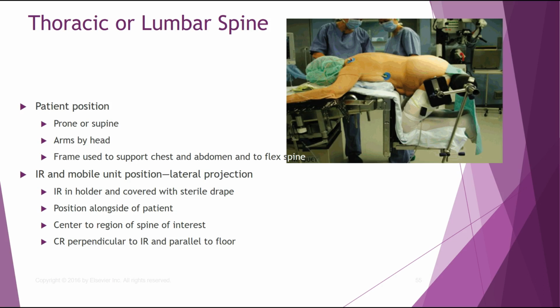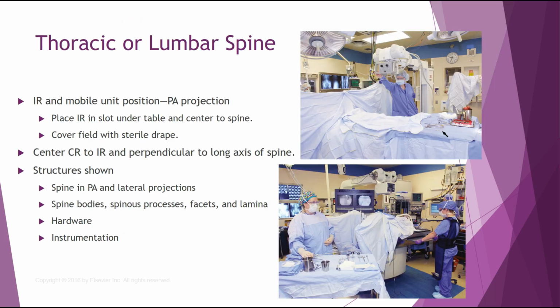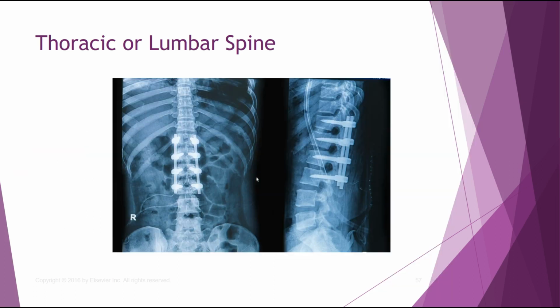All right, here is your lumbar spine patient once again, but this time they don't need a C-arm, they just need some radiographs, okay? Surgeon will let you know what he wants you to do. Okay, and this is a picture of a radiographer with the tube over the patient. And this bottom picture is another tube, the radiographer is placing the IR. Okay, here's some pictures.